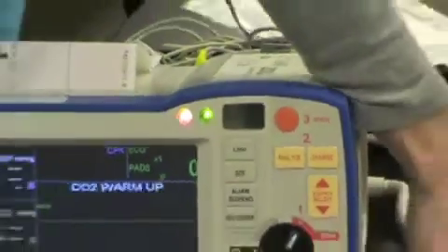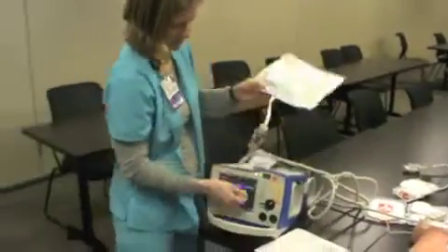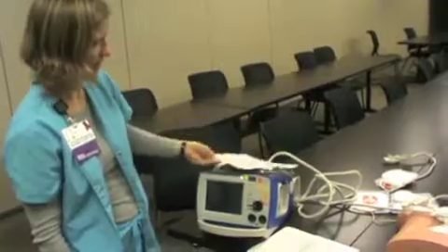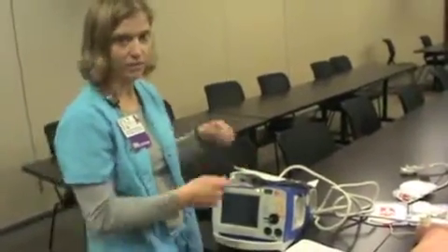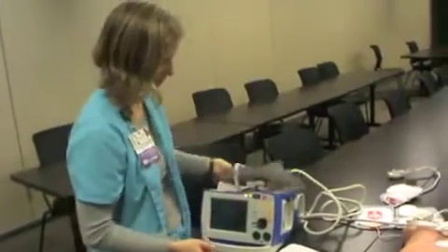So now we know that it's good to go, but we're going to plug it into the pads. This is how it should be all the time. It should just be at resting state plugged into the pads. So when you ever need it, you don't have to fumble around with that cord. You can just open the pads and get started.